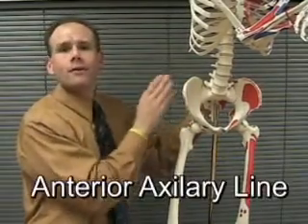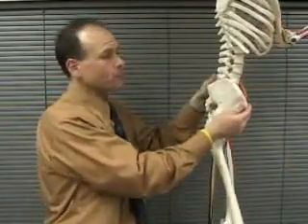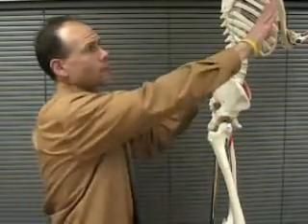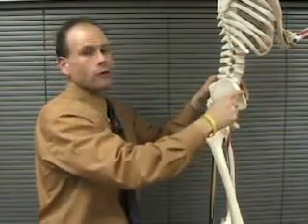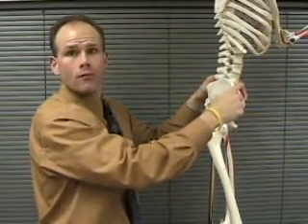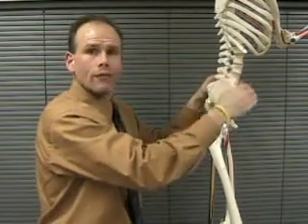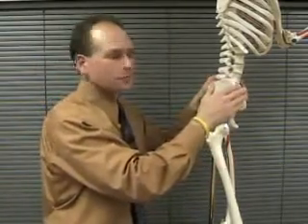The suprailiac measurement is taken in the anterior axillary line. I'm going to turn my subject, or the skeleton, to the side so you can see that. The anterior axillary line would come from the anterior armpit down, so from the anterior armpit down to just above the iliac crest. We want to go 2 centimeters above the iliac crest in that anterior axillary line and take an oblique fold. And the skin will really want to fold this way, so it's an oblique fold.